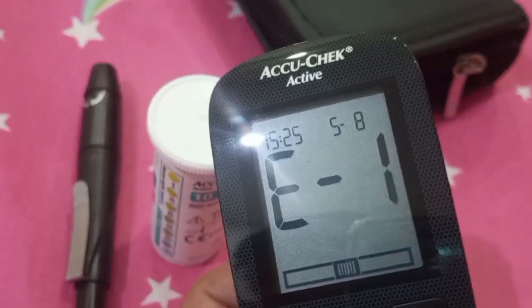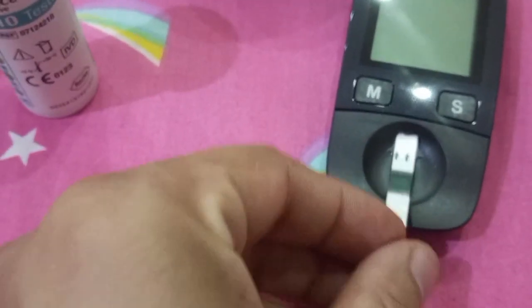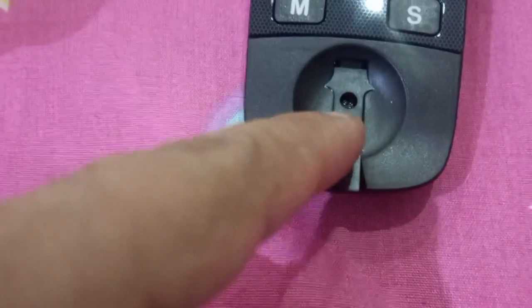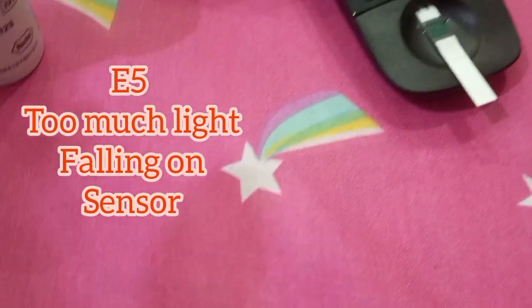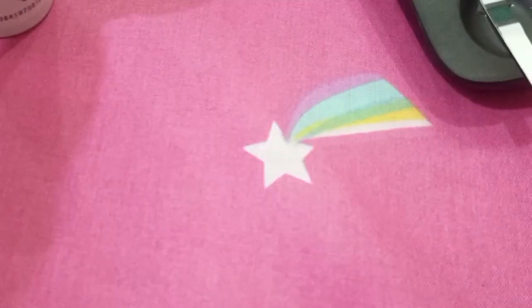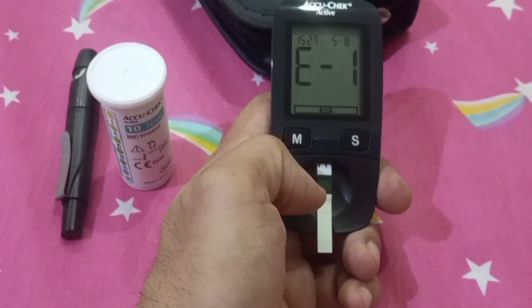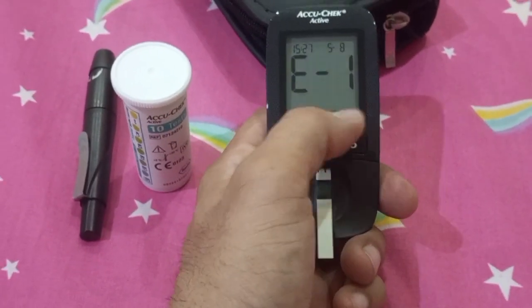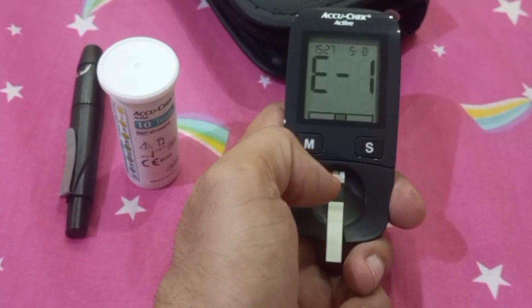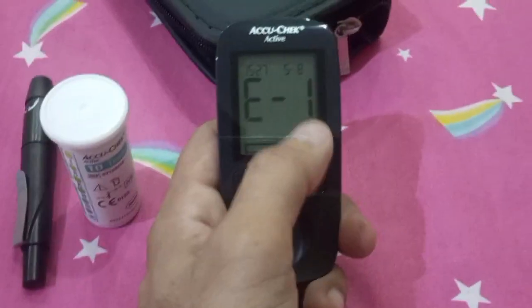Error E5 can also mean that there is too much light falling on the sensor. This sensor works with a red light beneath it, so excessive light can also trigger error E5. In that case, move to a shady area. In a normal well-lit room this should not be an issue — unless you are pointing a flashlight or very powerful LEDs directly at the sensor. So E5 can be due to two things: too much light falling on the sensor, or too much electromagnetic or cellular radiation nearby.